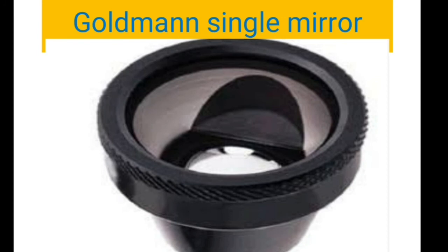The difference is mainly with the posterior curvature of the goniolenses. The posterior curvature of the Goldmann lenses is steep. The radius of curvature is almost 7.38. So this is steep compared to your cornea.